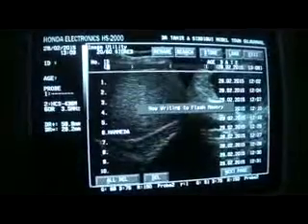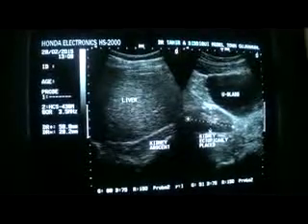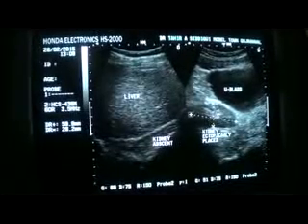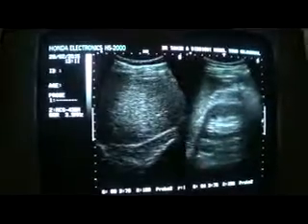Another thing is the size. Its size is relatively smaller in longitudinal section and is normal in anterior-posterior diameter. The parenchyma echogenicity is normal, the central sinus echo-complex is seen, and no calculus is seen. Now this is the left kidney — this is normal.